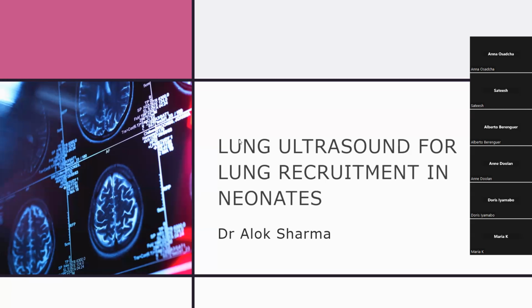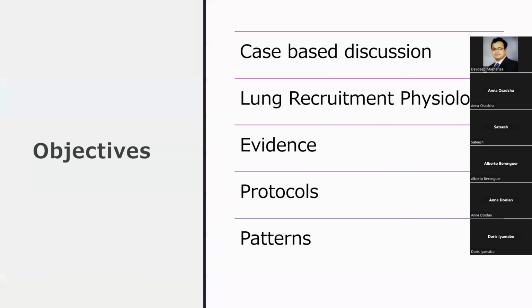Okay, so welcome everybody. Today we're going to talk about, I think, a very, very important topic. In particular, from now onwards, we are really going to look at strategies for intervention when it comes to using lung ultrasound. An important aspect of that is that you use all interventions in a manner that is safe, evidence-based and following a very structured protocol.